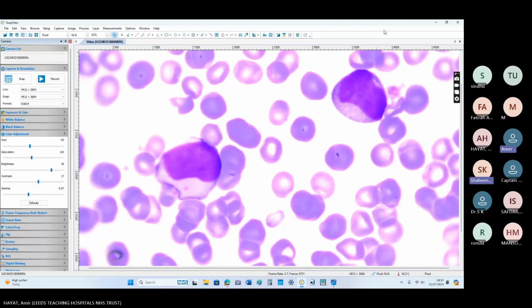Okay. So, this table is given in the BSH guideline. Remember it, it will be asked from you in the Viva or in this morphology question if it is there. So there are four categories. You will do FISH for inversion 16, 8;21, and KMT2A.